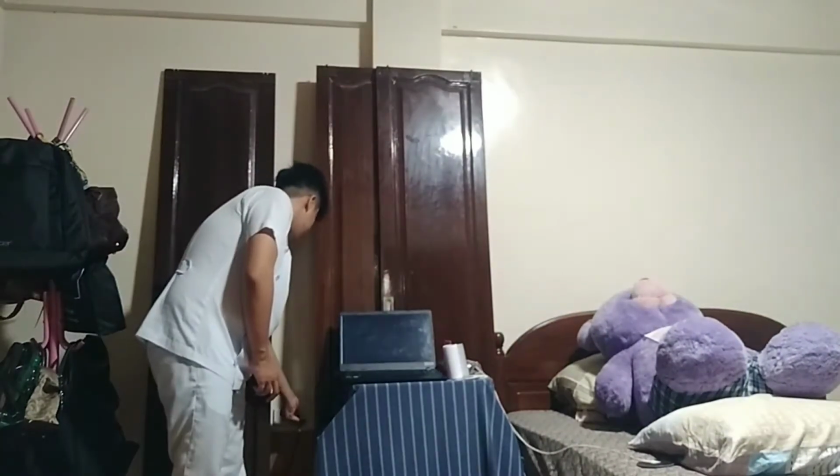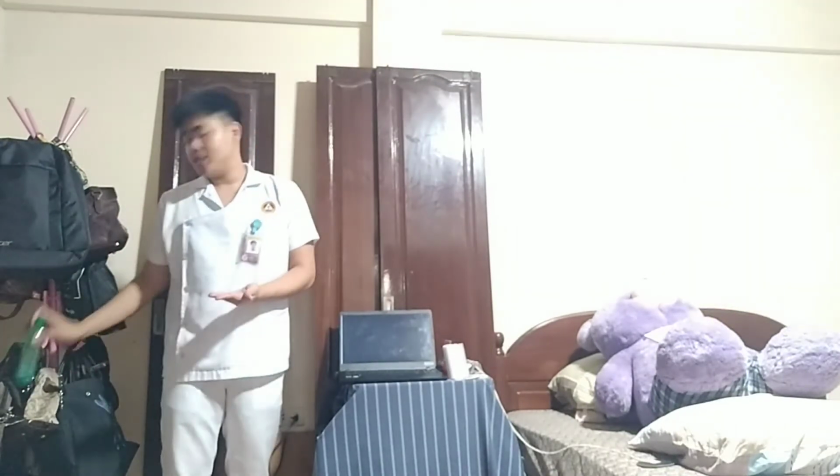and then plug in the power cord on the wall outlet. After that, we're going to perform hand hygiene and observe other appropriate infection control procedures. We're going to provide for our client's privacy and dignity by drawing the curtain and closing the door in the room. And then we're going to check the client's identification, comparing what the client states and his response. We're going to ask the client to state his name and his age.